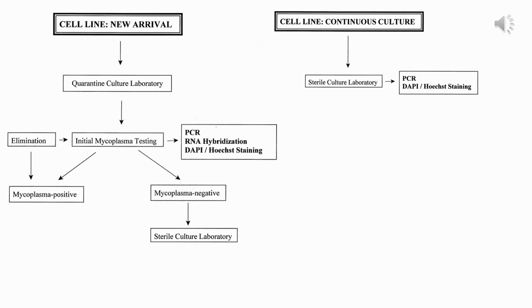In addition to the FBS, which is the second major source of Mycoplasma contamination, and our own mouth and saliva, which is the primary cause of Mycoplasma contamination, another way one can get this is when we procure cells from other labs, or even from some vendors.